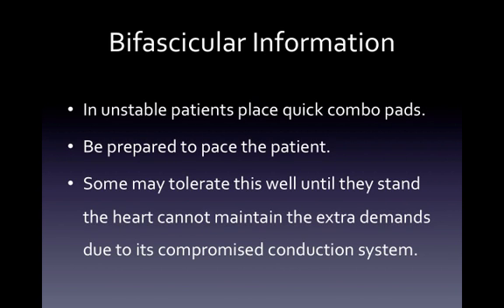In unstable patients, place quick combo pads on them immediately. Be prepared to pace the patient at any point. Some may tolerate this well until they stand. The heart cannot maintain the extra demands put upon it due to its compromised conduction system, and they could go into complete heart block, which would be a third degree AV block, very, very rapidly.